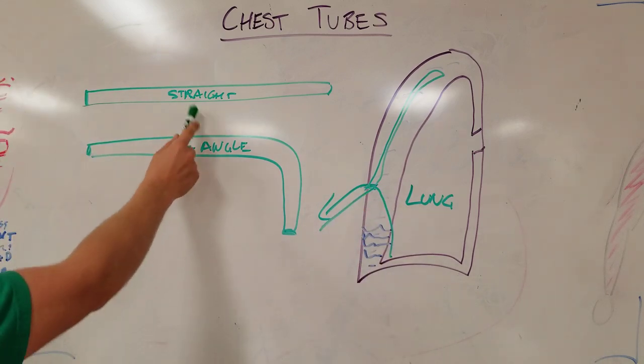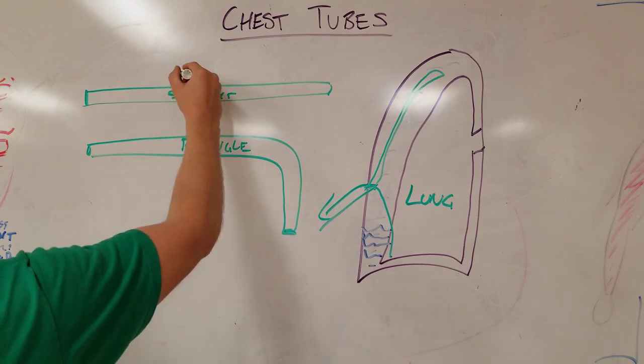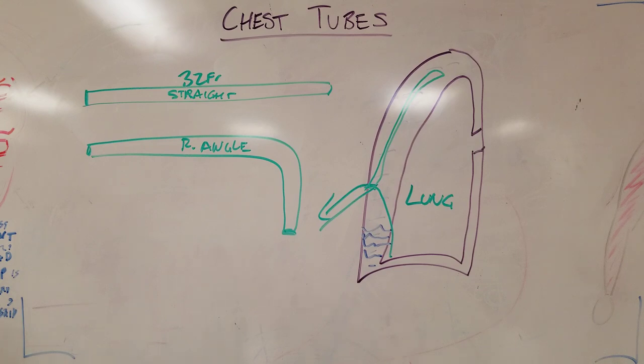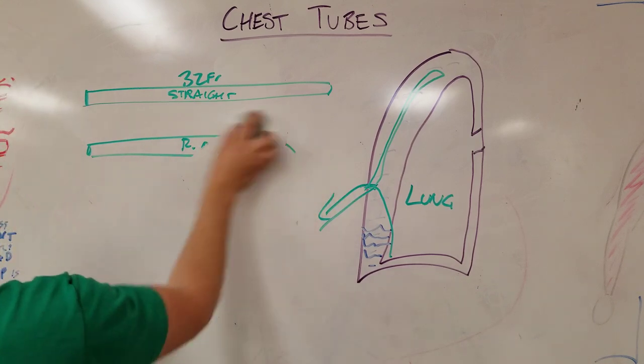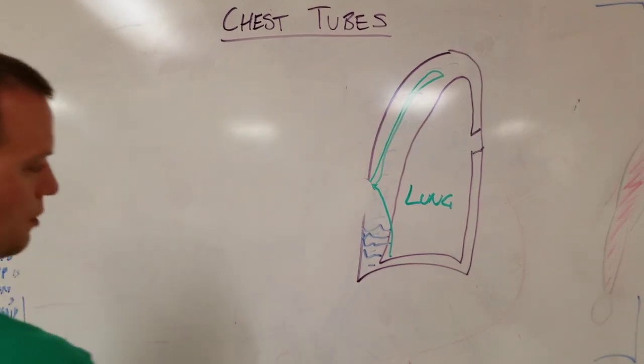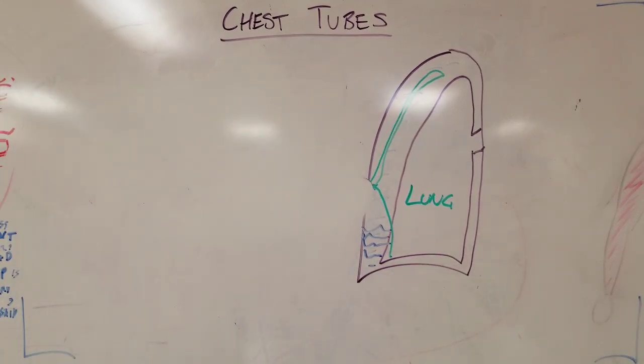Again, common things being common, what you're going to see is something like a 32 French straight chest tube, and you're in business if you have that. If you're just trying to decompress someone's chest emergently, it doesn't matter what kind of tube you have, you just need to put a hole in their chest with a big knife and get the air out of it.